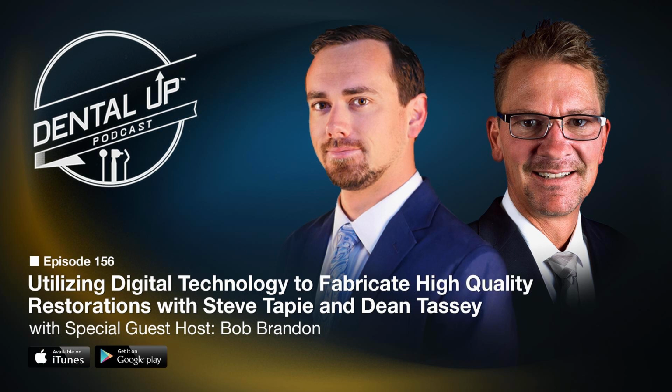What I want to stress to our listeners is that digital impressioning is not a technique to bypass margin isolation. Margin isolation, what you were taught about isolating a margin either with cord, chemicals, or heat, or with physics and a laser, cannot be bypassed. We do need a nice, clear, well-defined margin to fabricate the types of restorations that you, our customers, will be proud to deliver.